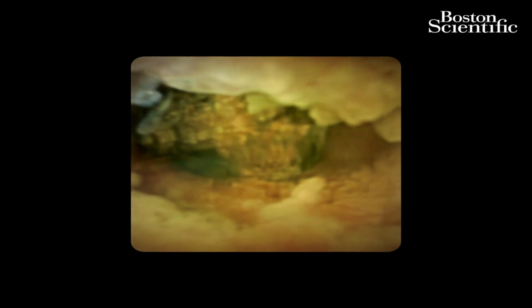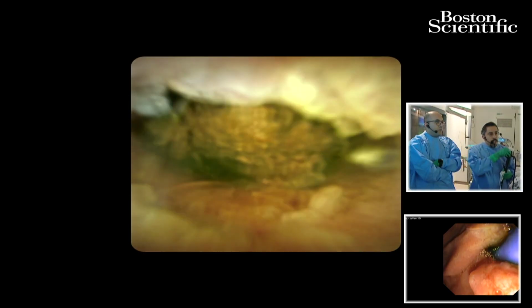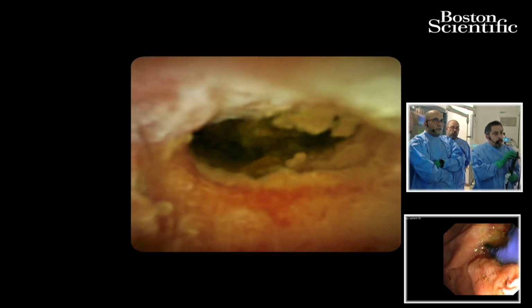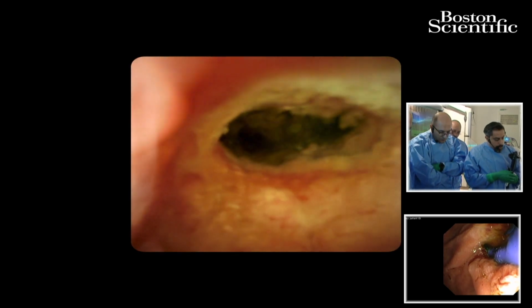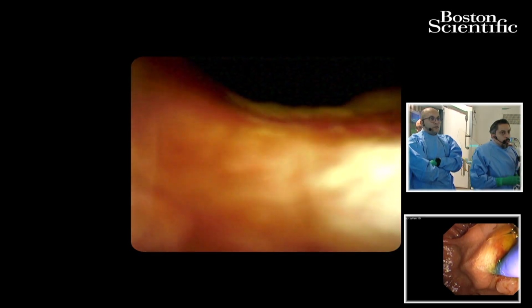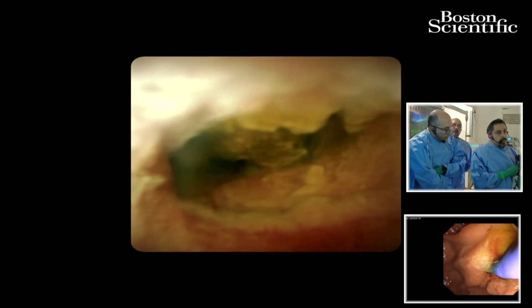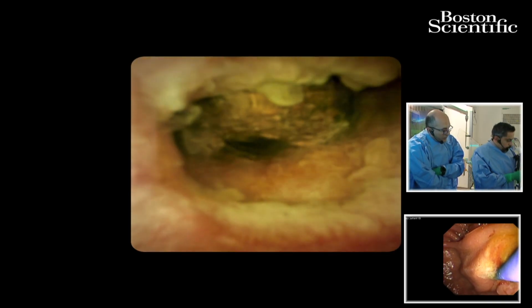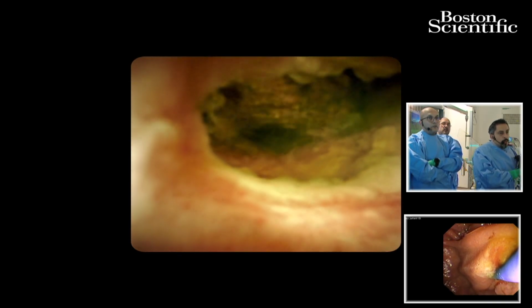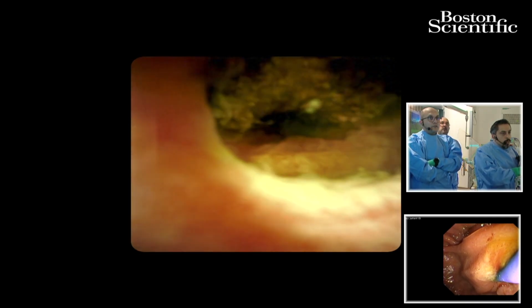So, okay. The most important thing here, the most challenging aspect, is passing the probe inside. It is very thin and very fragile. Looks like you're in with the SPY, so that's good. But while you're at it, were you able to see the stricture? Now you can have a better evaluation of that potential distal stricture with the SPY.